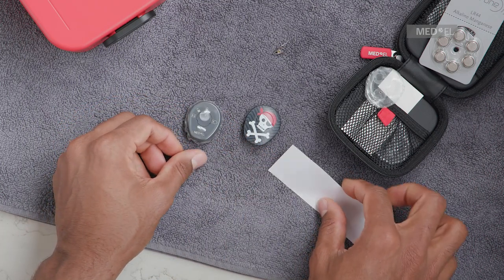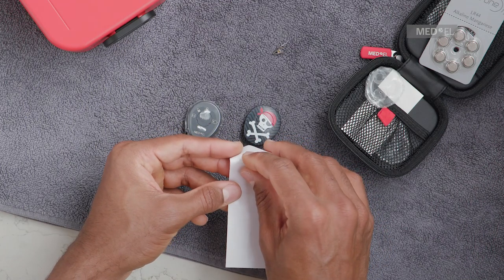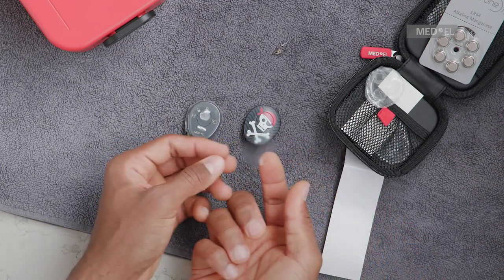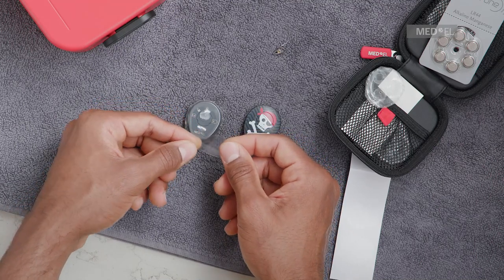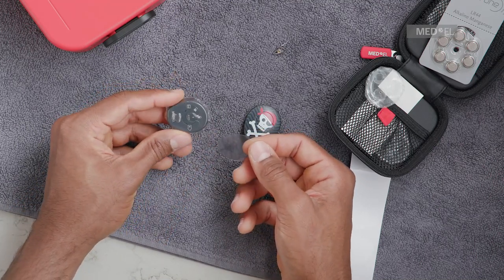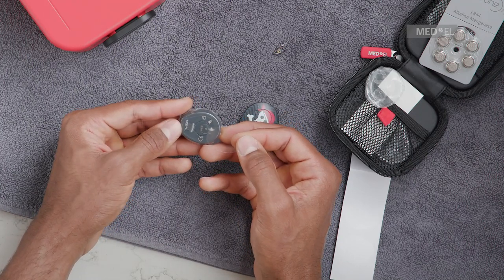The adhesive seal tape is used to cover the opening of the skin. Make sure that all components are clean and dry before you attach the adhesive seal tape. Remove the adhesive seal tape from the protective cardboard. Start applying the tape on the side where the battery compartment is.